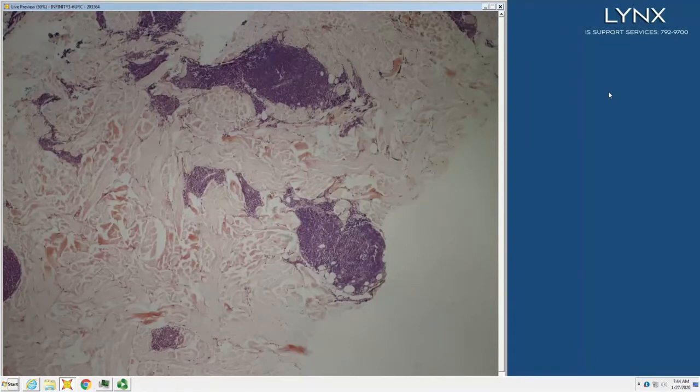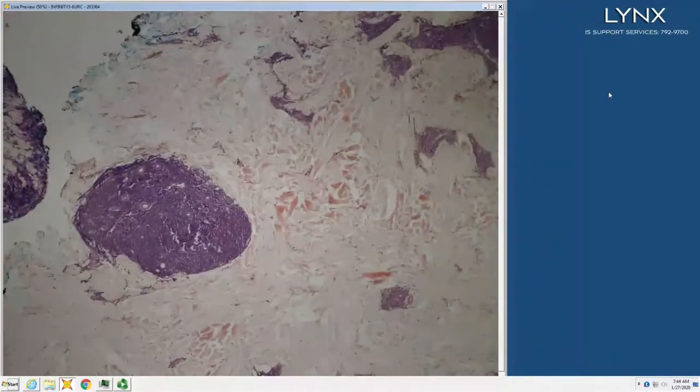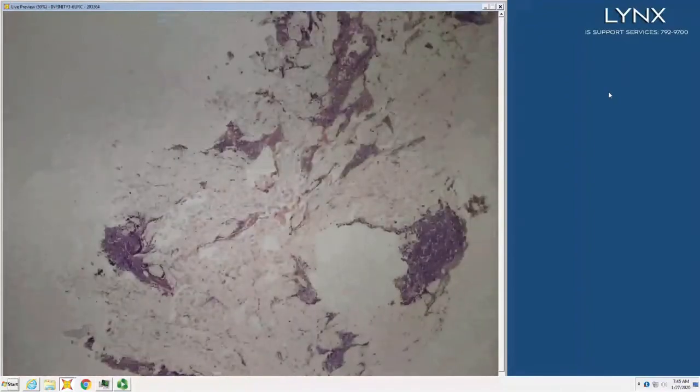Half the time they were not aware. But you can see it, just those dense B cell infiltrates that are CD5 positive, CD20 positive, that just don't go away and keep on going as you do the subsequent Mohs stages.